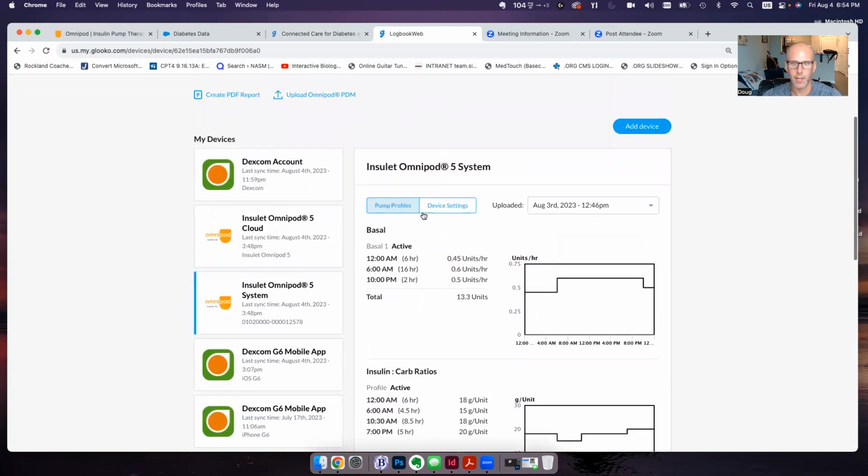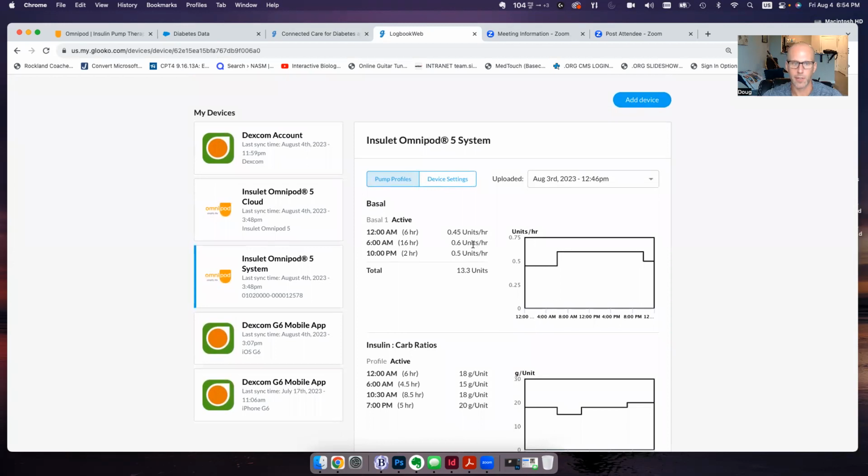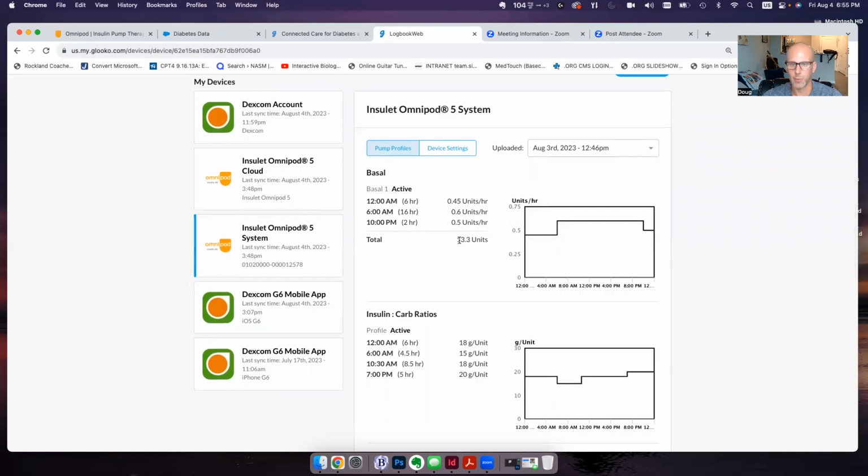So now we'll see, because I literally just did this and my Omnipod is still limited because it's trying to connect to my transmitter. But all of my settings have now been recreated to exactly what they were as of yesterday. And so I'm hopeful that this doesn't happen again and that I'm okay for the future and for the rest of today, that I don't have to worry about anything weird. But having gone through this, it's a little bit frantic, especially if your blood sugar is in a bad spot. You want to get it fixed as quickly as possible.